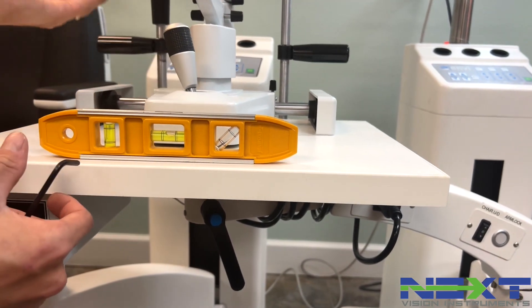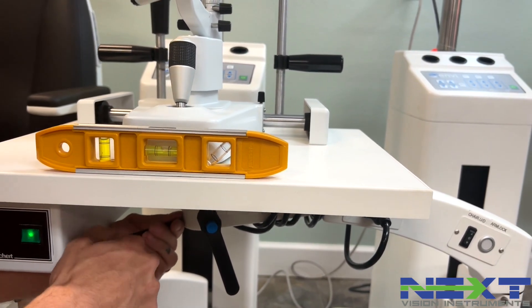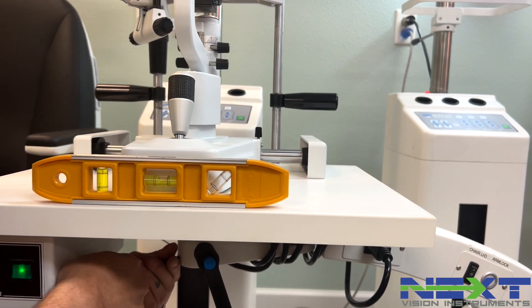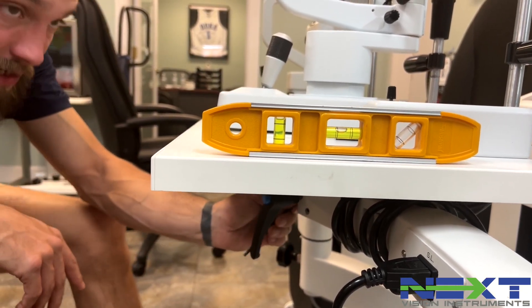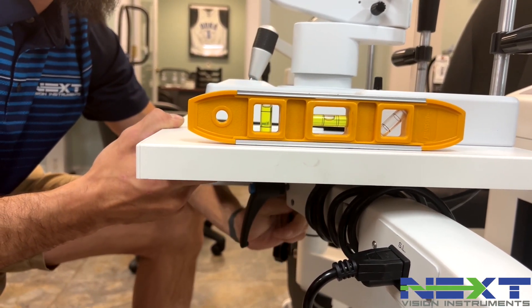Your slit lamp doesn't walk away from you. We'll just snug the rest of them up and try to get a little bit more level. And if you need to go back one way, just loosen one side and tighten the other in small increments, so you don't have to start all the way over.